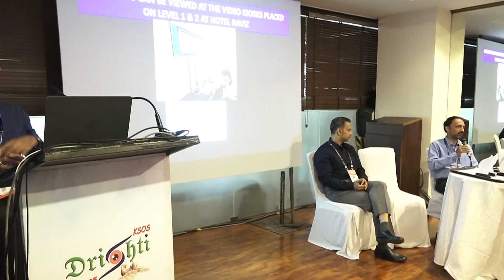OCTA in a busy OPD? I mean, do you just click and the whole wide field comes? Because with the montage, it's extremely difficult.